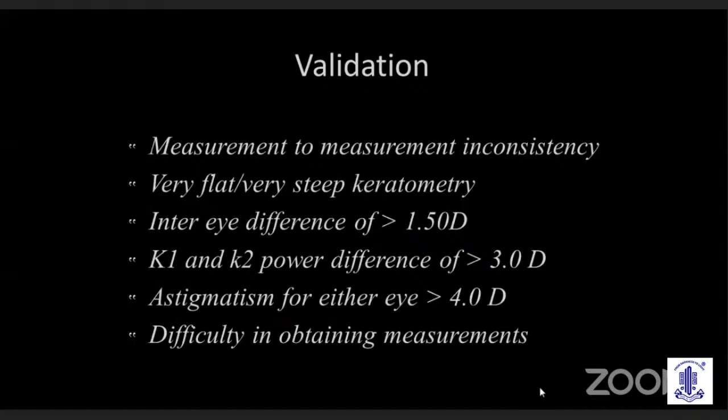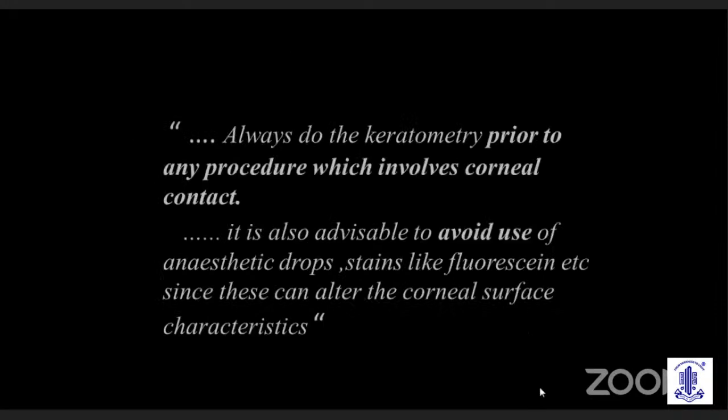Whenever you have a doubt, whenever there is a measurement to measurement inconsistency, a very flat or steep cornea, an inter-eye difference of more than 1.5 diopters, a K1, K2 difference of more than 3 diopters, or if you have difficulty in obtaining measurement, validate your measurement with another examiner or ask the patient to come on a different day and do the examination. Always do the keratometry prior to any procedure which involves corneal contact.